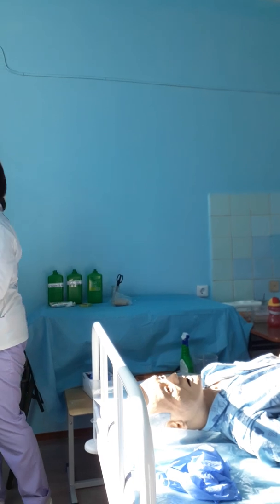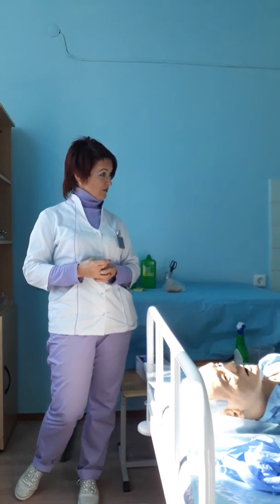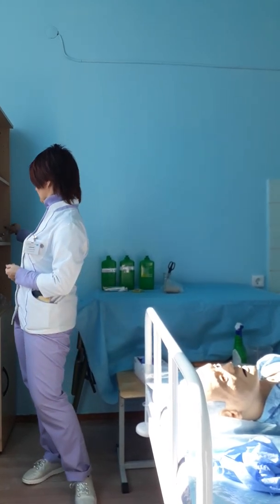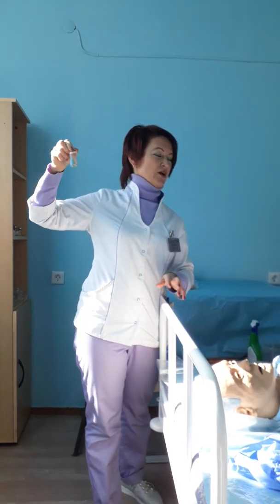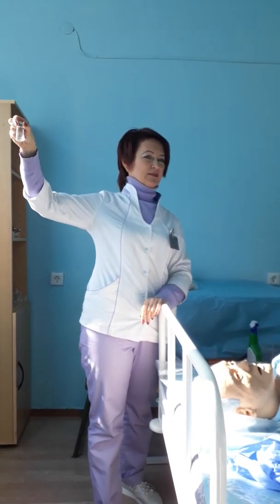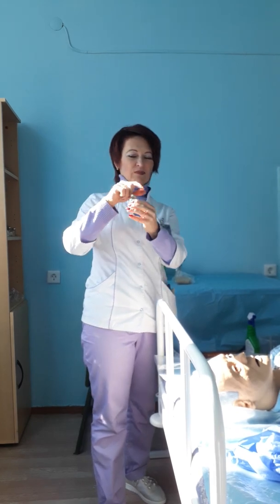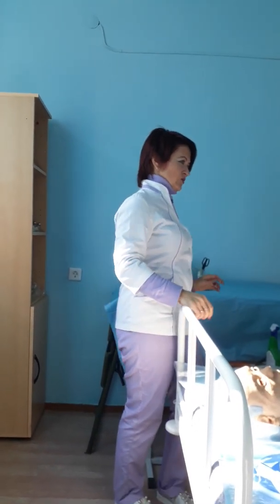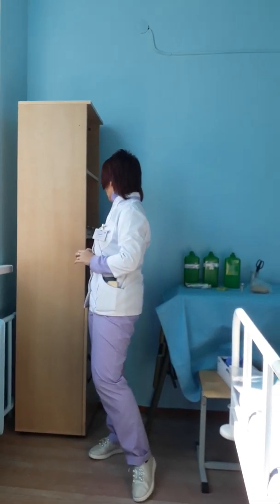You open your medical cabinet, and first you must prepare the medicine. You find this medicine, and now you check. What do you check? Name, concentration, volume, date of integrity, and expiry date, and afterward the color and clarity. Can you use this solution or not? And afterwards you prepare medical items.